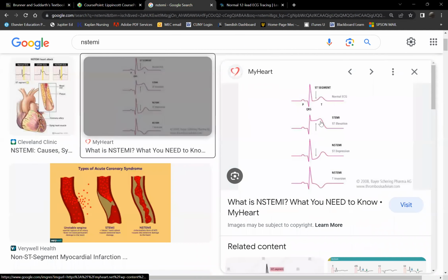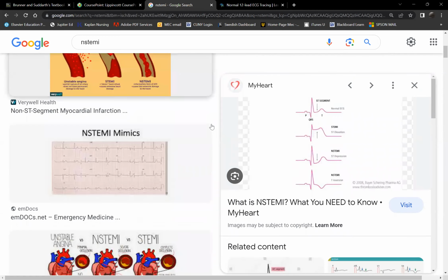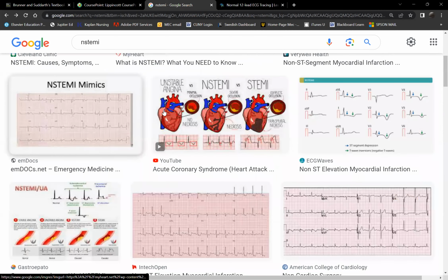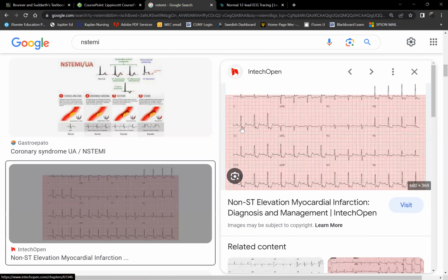It looks depressed now. And with T wave inversion. This is T wave inversion. That's not a very good example. Let's look at another one. Right here. So here the ST segment is supposed to be isoelectric. Is it elevated? No, it is depressed, it's low. Okay, here's your T wave, supposed to be up here, right? Now it's depressed.